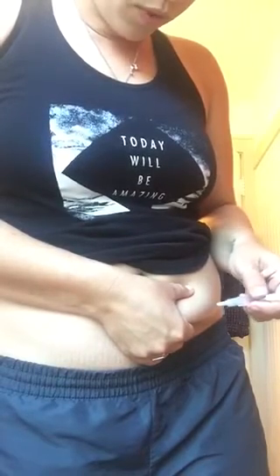Okay, so I wiped off this area of my belly. I'm going to pinch again. Let's see. The toilet is right in front of me, so there's no real good way to do this. So, okay. Ready? 1, 2, 3. Does not hurt. It's not even as bad as being stung by a mosquito.